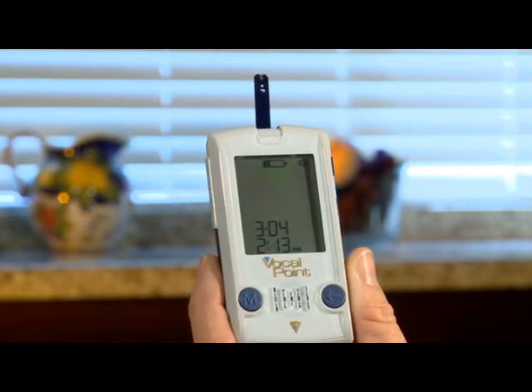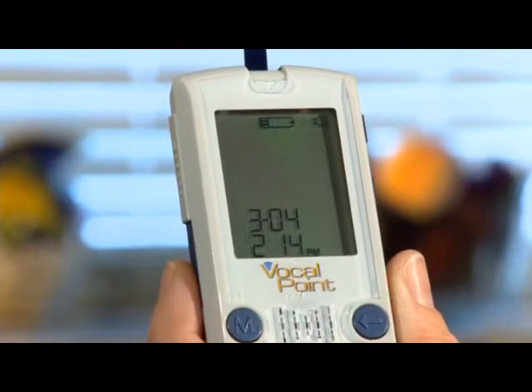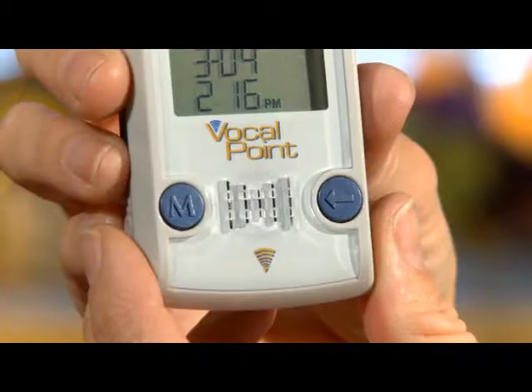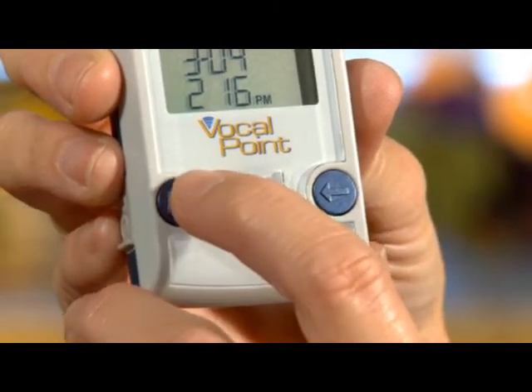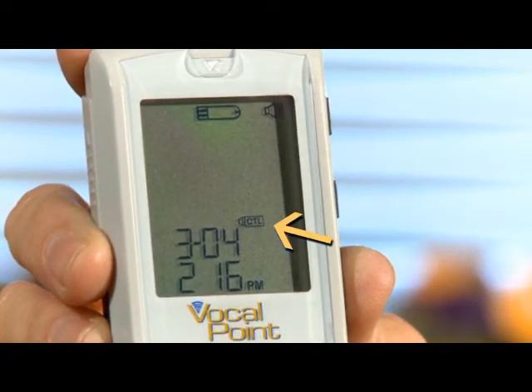You'll hear an indication to apply blood to the test strip, accompanied by a picture of a test strip and a flashing drop. Next, press the memory button, M, once and CTL will appear toward the bottom of the main display.